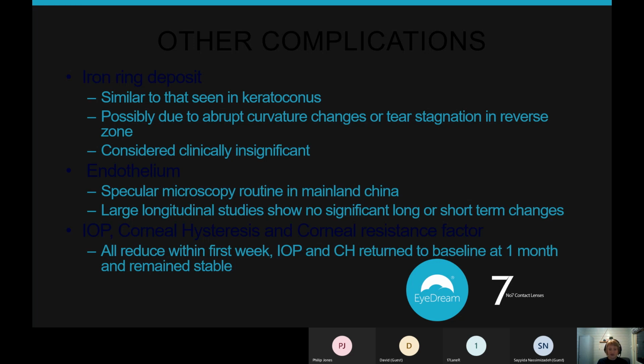And as far as pressure is concerned, probably the take-home message is that your cornea thins slightly centrally, so the measurement of your IOP is likely to read 1 to 2 millimeters lower than it would if you didn't have Ortho-K. So that really only is important for patients who are a bit borderline and have other risk factors. I think in the future we're going to be measuring corneal thickness and combining that with our pressure measurements anyway, so maybe that will become less of an issue.